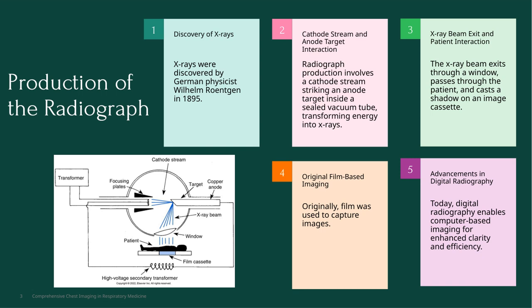Originally, this process relied on film to capture the images, which was the standard for many years. However, with advancements in technology, digital radiography has become the norm today. This allows us to create images using computers, offering much clearer images and more efficient workflows, ultimately improving patient care. Understanding this process helps us appreciate the technological evolution behind the chest imaging we use in respiratory medicine.